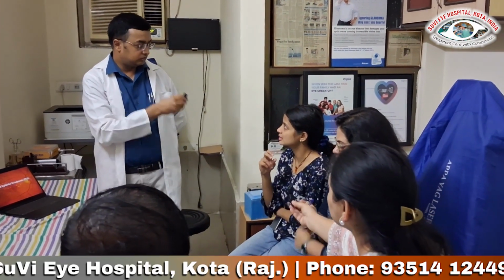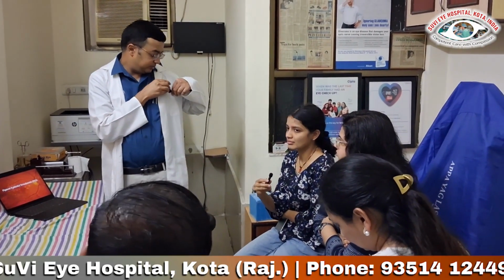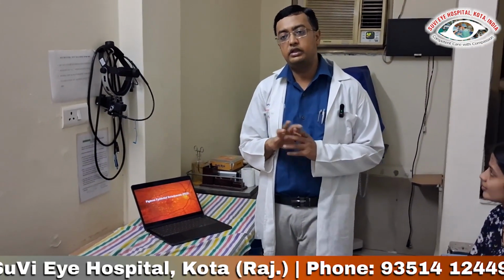So what happens in the double-layer sign? Anyone? RPE and Bruch's membrane. Loudly. RPE and Bruch's membrane separation. Yeah, very nice. So RPE and Bruch's membrane separate with the presence of hyperreflective material in between. And the last thing is a sub-RPE ring-like lesion. I am emphasizing this because if we see this kind of picture, then practically our diagnosis will change to polypoidal choroidal vasculopathy.